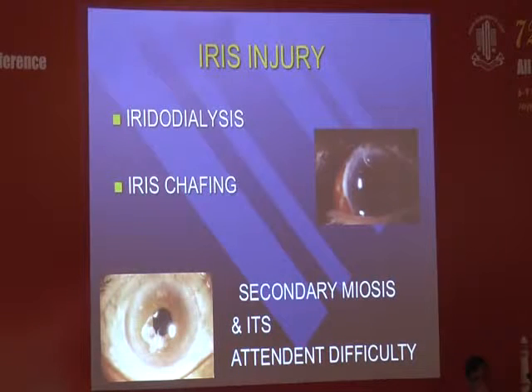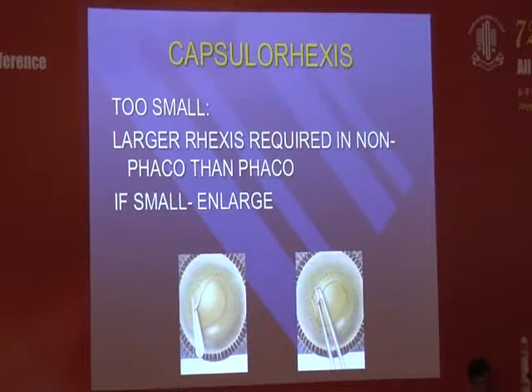We always feel that the resident or some other person is not instilling the drops. No, it is because of the miosis on the table. Miosis on the table is because of handling in the eye, not because of less medicine or they have not put the drops or anything. No, it is just handling, and that handling can cause this type of thing in the procedure. Now here the rexis, if it is very small, then you will have to extend.